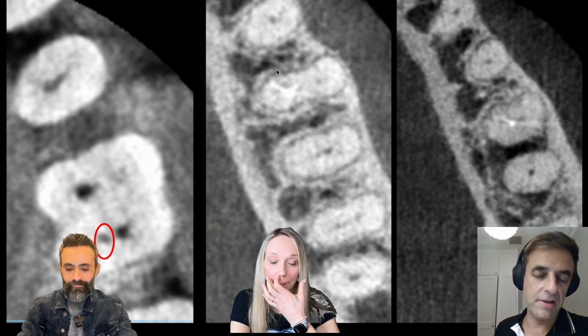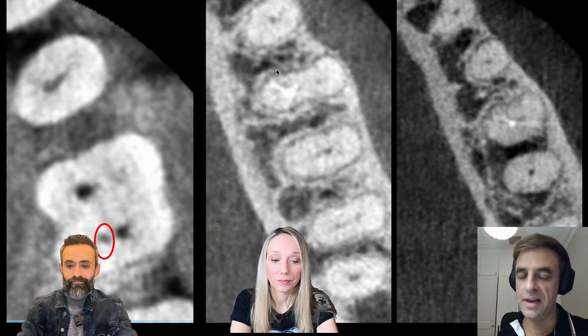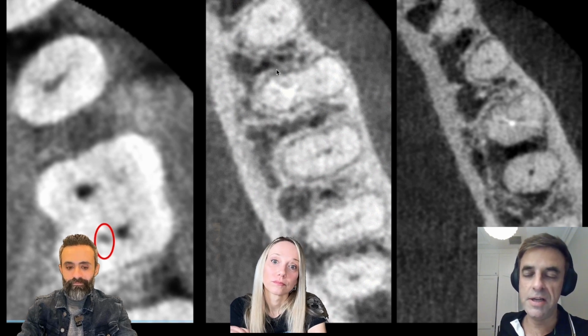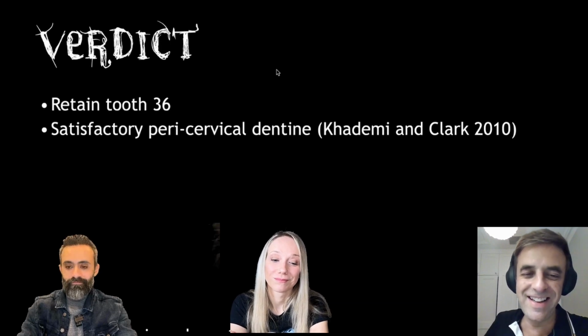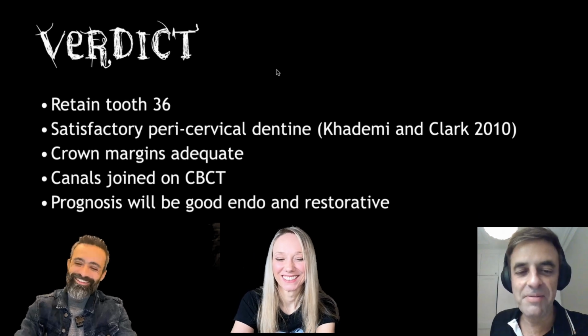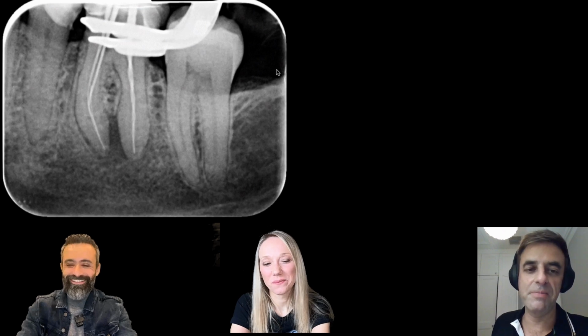I'll locate the distolingual root canal, which wasn't treated originally, and your tooth has got a really good prognosis. That, coupled with the pericervical dentine, means your tooth is in a good situation. And this is what the patient wanted to hear. In fact, I completed this case, and the patient gave me a massive hug. It was one of those kind of fun ones where the patient hugged me and said, "I'm so happy I came to see you." But that was really nice. But yeah, there's a really good prognosis for this because of the pericervical dentine.